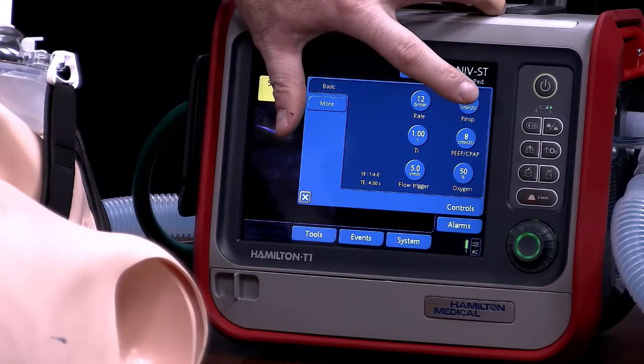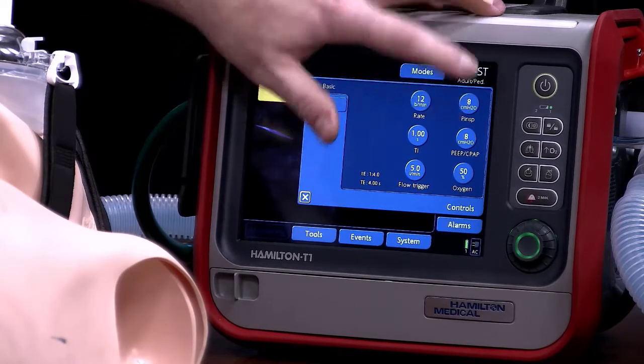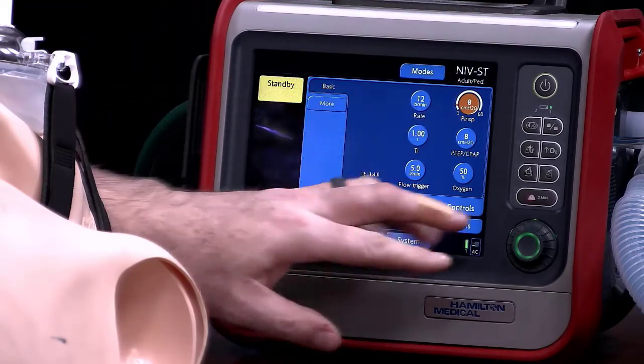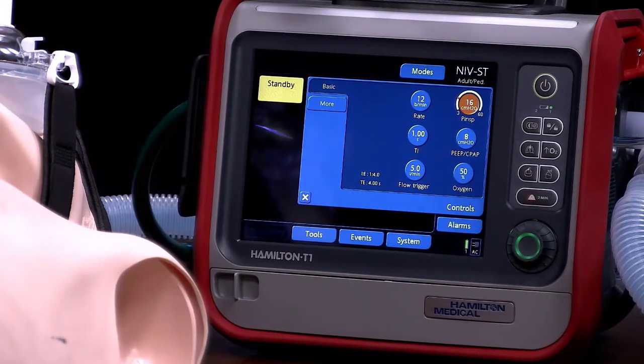This is your inspiratory and expiratory pressures. The whole purpose of BiPAP is to have a different pressure on inspiration than on expiration. Your expiratory pressure is your PEEP — in this case it's set at 8, we'll leave it at 8. Let's say your inspiratory pressure was set at 16 at the hospital — so we're going to change our inspiratory pressure to 16. We're going to put the patient on 75% FiO2. These are settings that are going to be determined by the status of the patient with consultation from the doctors and respiratory therapists — that's not something we're going to be adjusting ourselves or determining in the field.